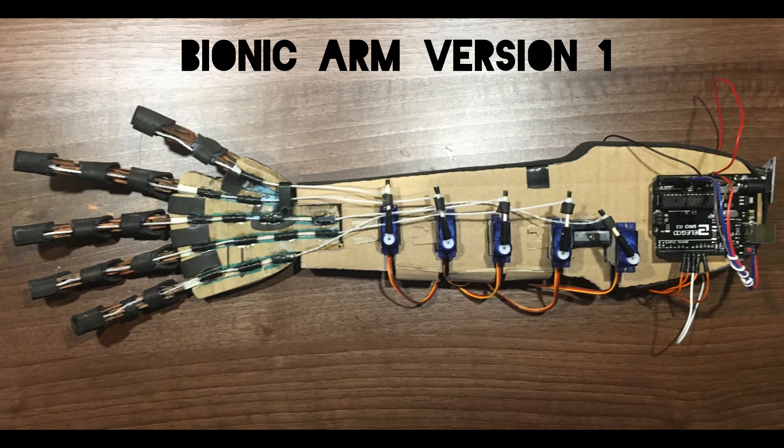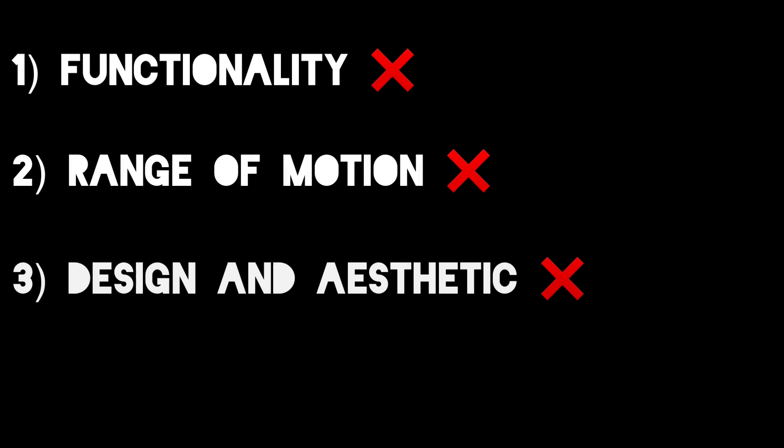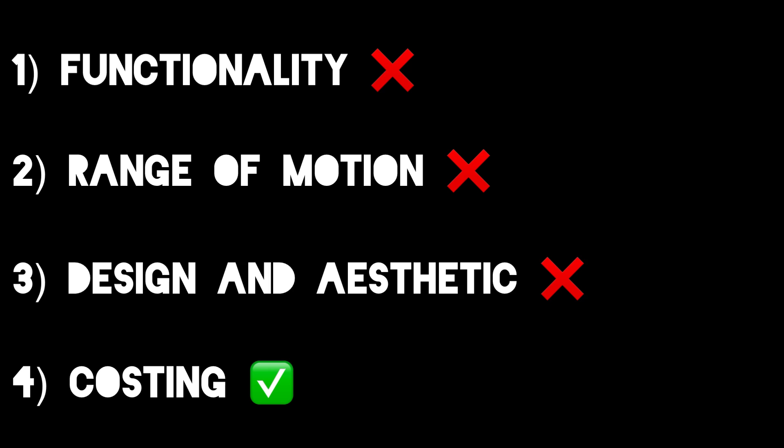I experienced numerous problems with this arm, ranging from not powering the circuit properly to joints in the fingers having too much friction. Functionality, range of motion, and design were not met, so I decided to build a second arm.